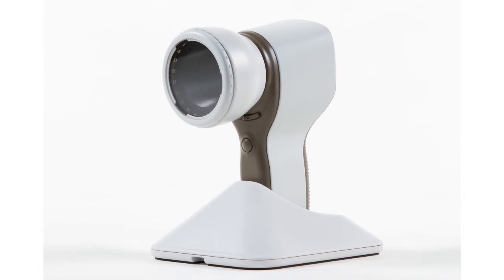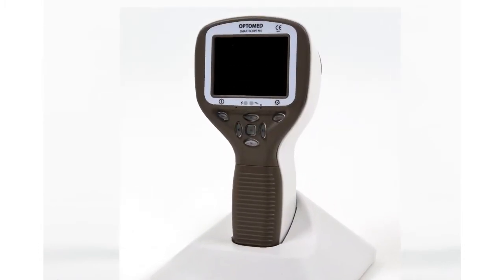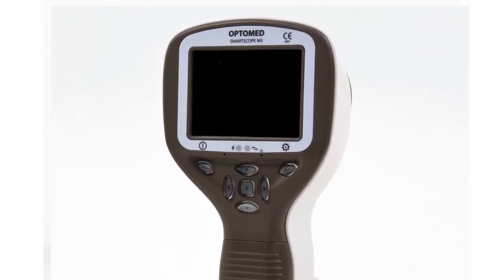SmartScope M5SK1 is a digital dermoscopic camera that enables examination of the entire skin surface and documenting patient data through digital images and video. First, let's go through the basic use and settings of the device.